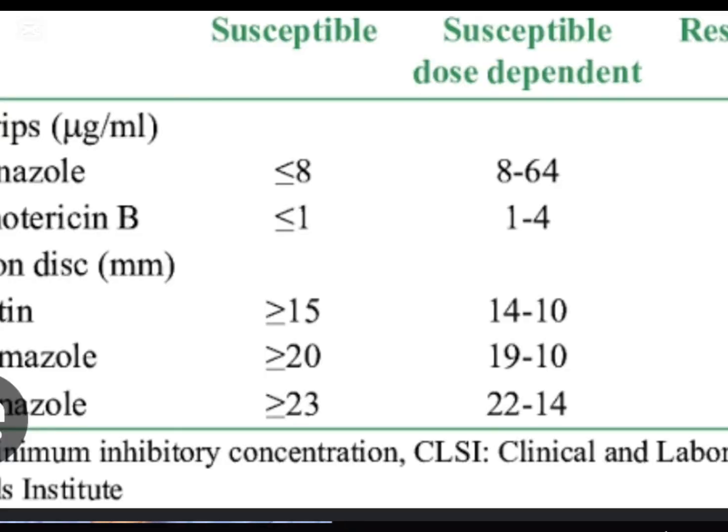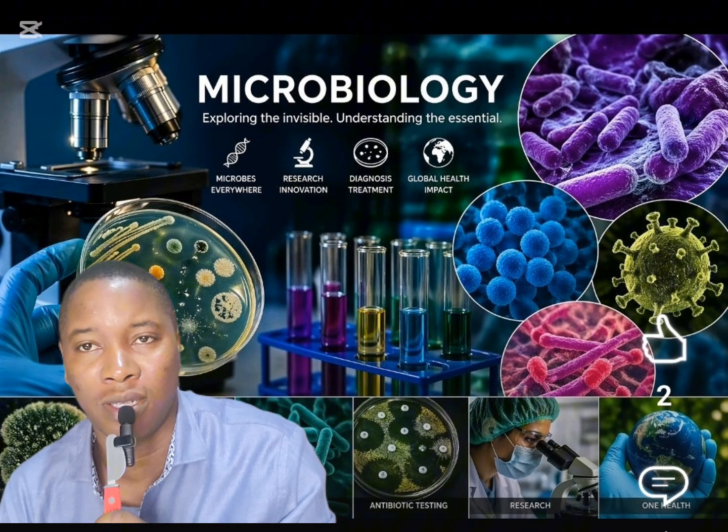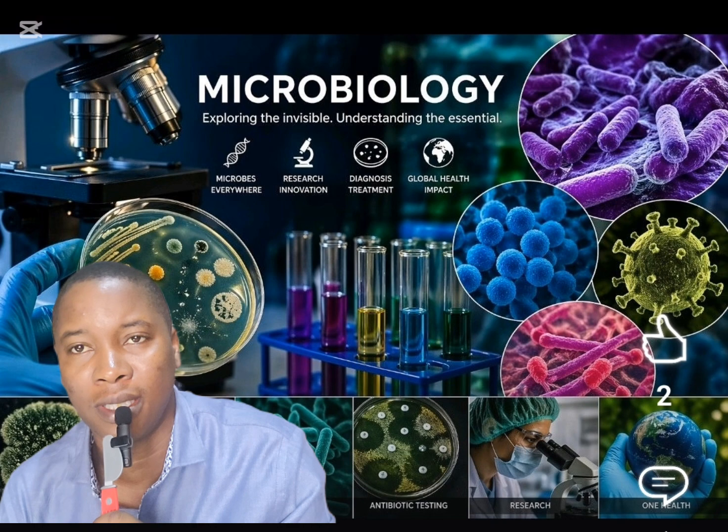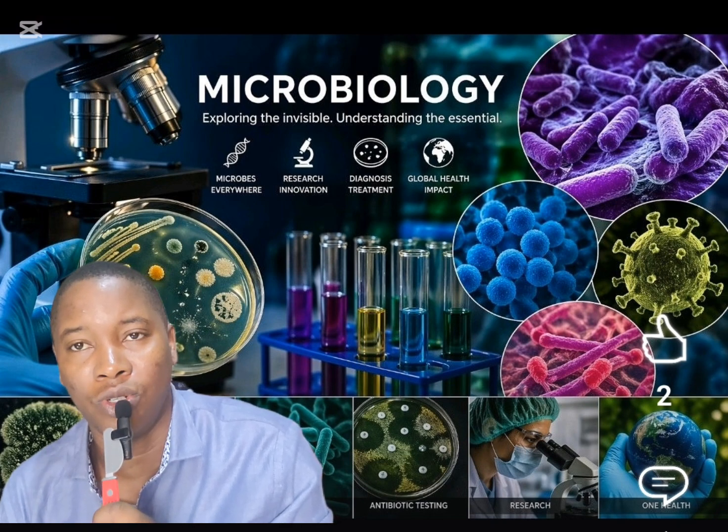It's one of three things. It's either that the pathogen is resistant to the antibiotic or is sensitive to the antibiotic. Sometimes some say intermediate, but I think that term is being phased out. So we usually have resistant or sensitive.